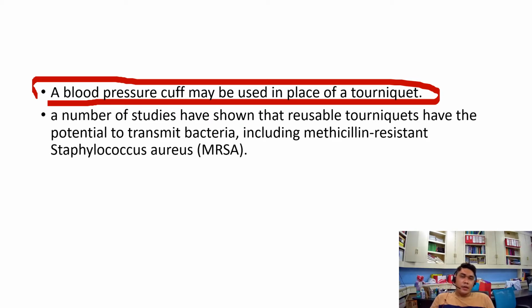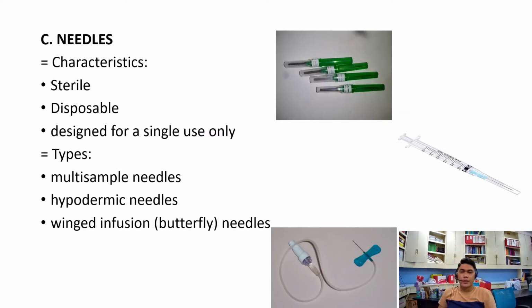Okay? The best is not to reuse the tourniquet, to avoid the transmission of MRSA. Okay, so next you have needles for venipuncture.